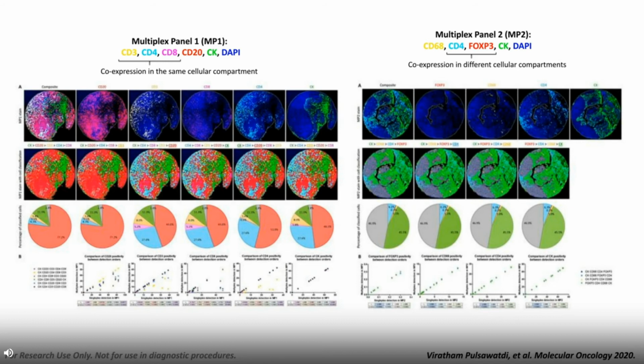only took 2 rounds of multiplex wet lab optimization and consistently demonstrated similar quantities across all different measure orders of biomarkers applied in digital image analysis. So as you can see here through the study, it's important to consider how the wet lab work influences your digital analysis. But what happens if we can't control our wet lab or our digital components? What if we only receive, as a researcher, an image to work on?